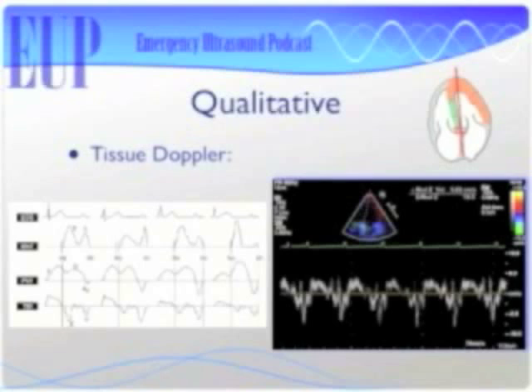Fine. Good man. All right, so let's put it all together here. So now we're looking at tissue Doppler, and in this example, Matt, what do you think about the E prime wave versus the A prime wave? Are you done? Do you need to do nothing else here? I think the E prime is smaller. Yes, the E prime, you can actually see, you can cheat if you want and look right at the top of the screen and say that somebody's already measured it and it's 5.65 centimeters per second. So that is? Less than 8. Right? Abnormal. So this person has abnormal diastolic function. And I can tell the E prime is less than the A prime, which goes along with that, right?